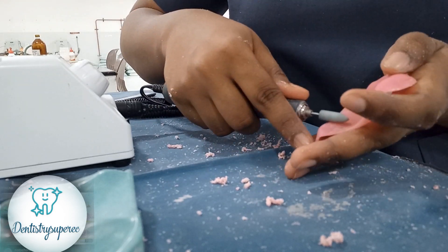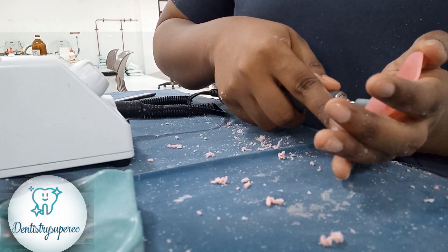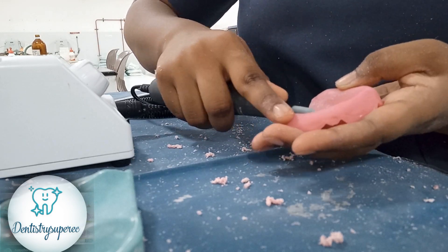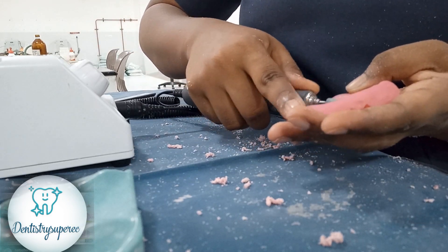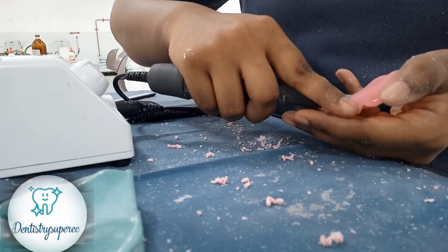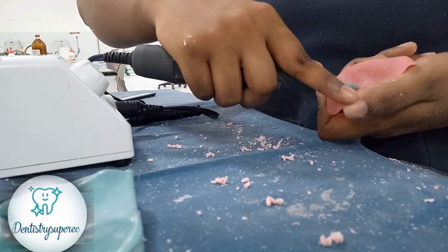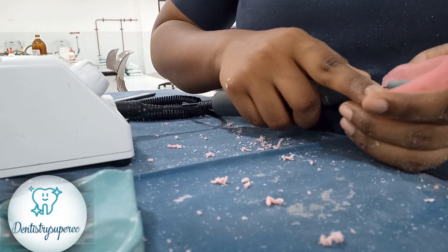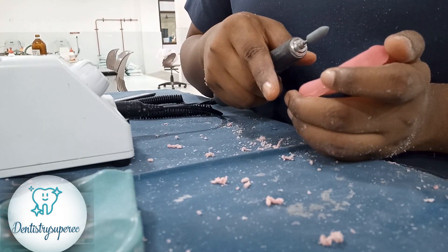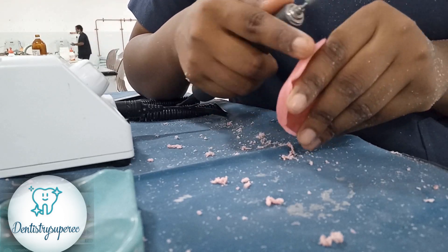We haven't reduced the bulk. Now this is another acrylic trimmer — there are many color codings, you get pink and white. If you feel any roughness you can smooth the surface with these burs, and later you can use sandpaper. Whatever you do, it should always be done from coarser to finer — when you come towards finer it gives more polishing to the surface of the denture.